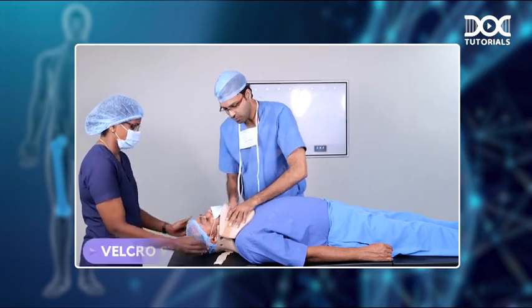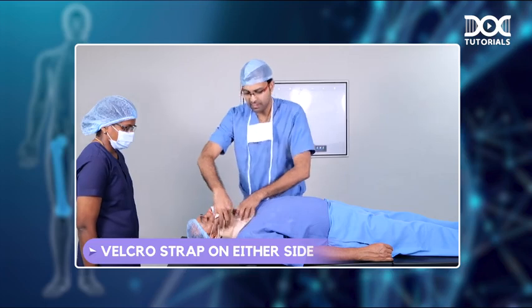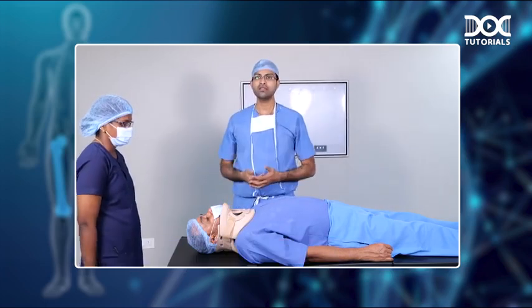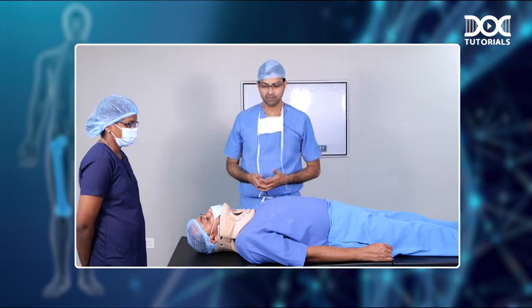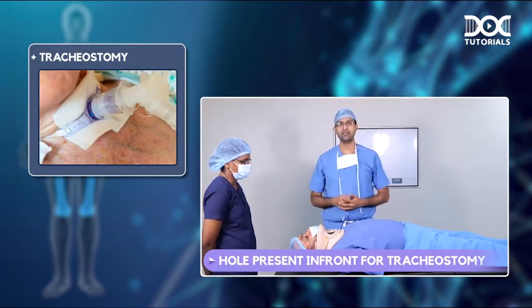And you have Velcro straps on either side which can be used for stabilizing the anterior part like this. So this is how you apply the Philadelphia collar. Remember, you have the hole in front for applying a tracheostomy if the need may be.